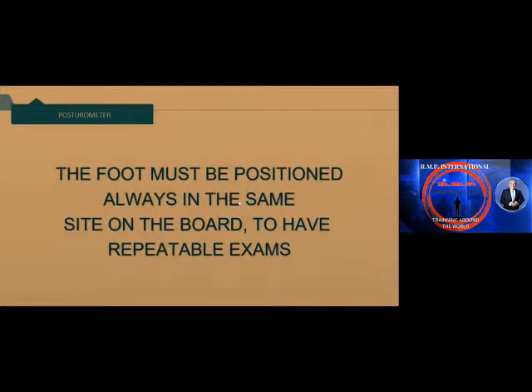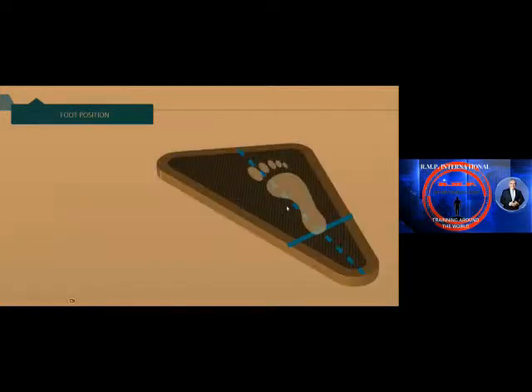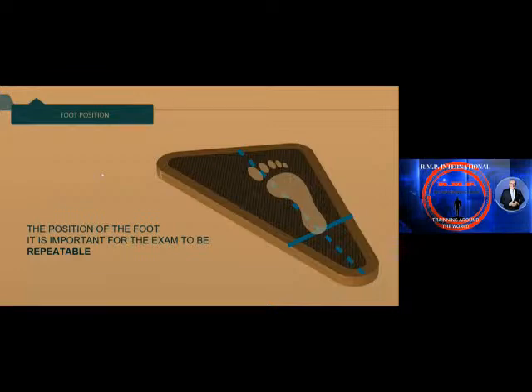When we do the measure, the foot has to be positioned always in the same position. We have a very simple sign. We will position simply here. And we can repeat the exam. And that is science. Follow the clinical protocol, obviously.